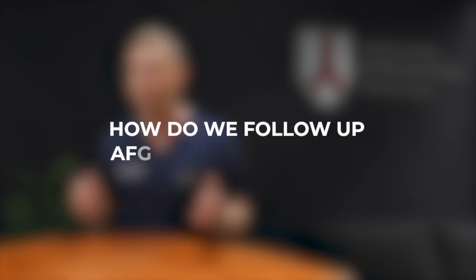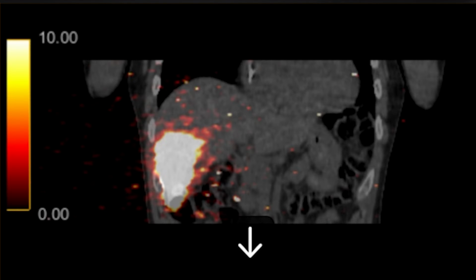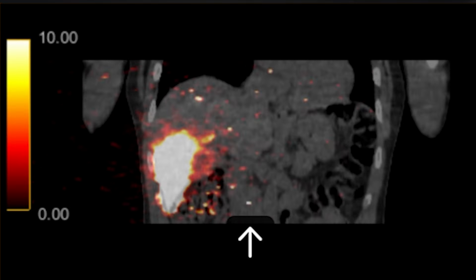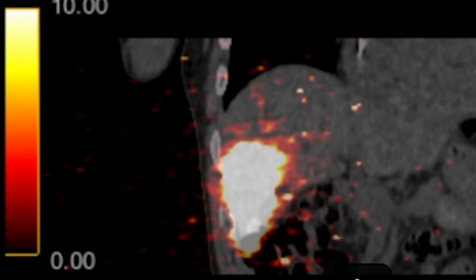And how do we follow up after the procedure? So for most patients, immediately after the procedure, we'll do what's called a PET scan. We don't have to inject you with anything else because we already injected the radiation directly into the liver. But the PET scan will show us exactly where we deposited the radiation and what we treated. We can also calculate the dose of radiation that went to that area based on the PET.